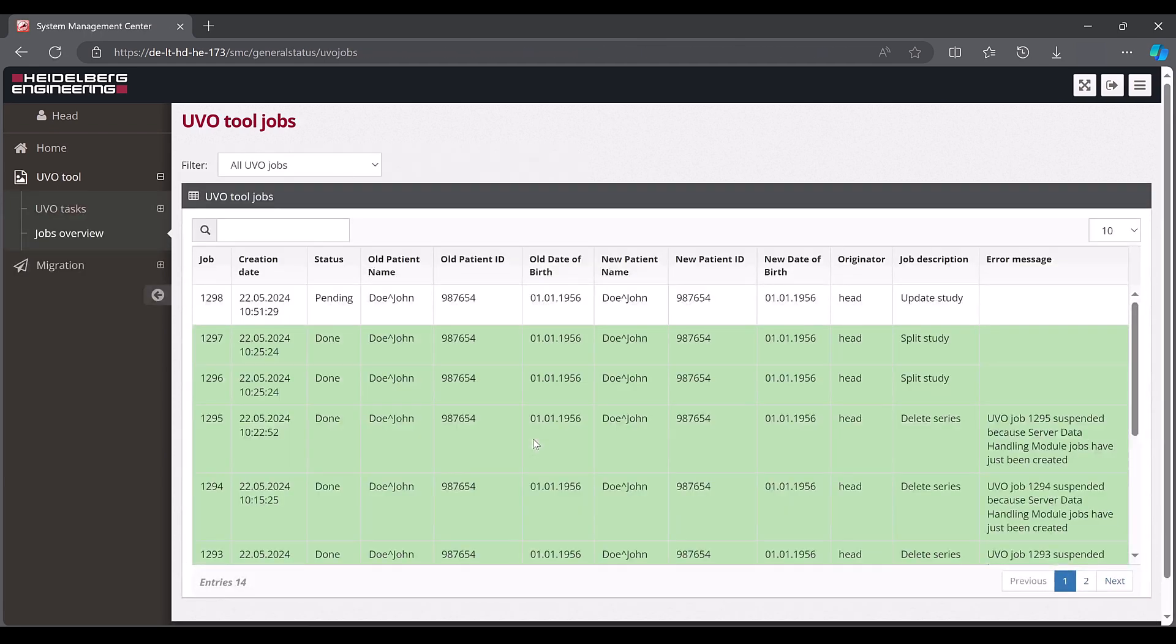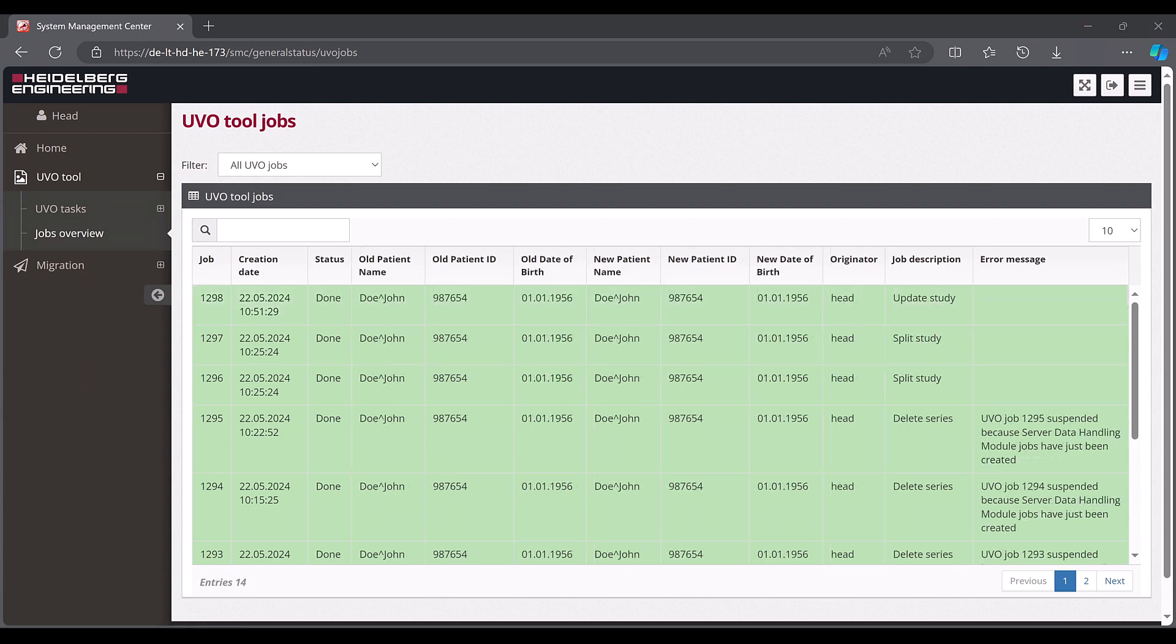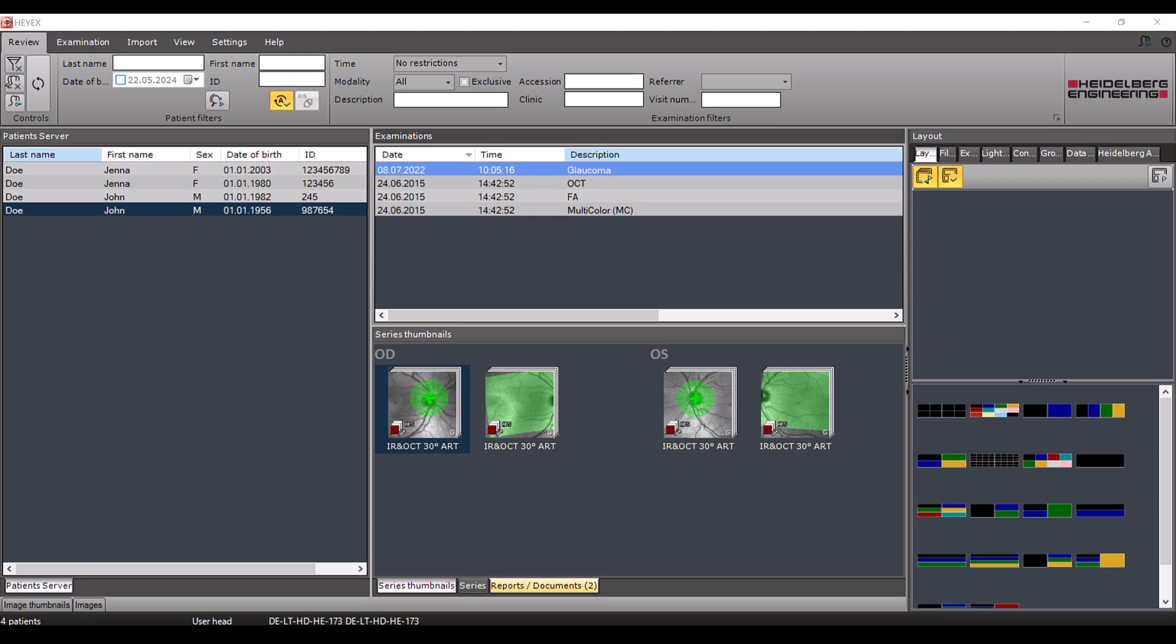As soon as the UVO tool has successfully completed the job, the changes are also visible in the navigator. Now the description simply shows the name glaucoma.